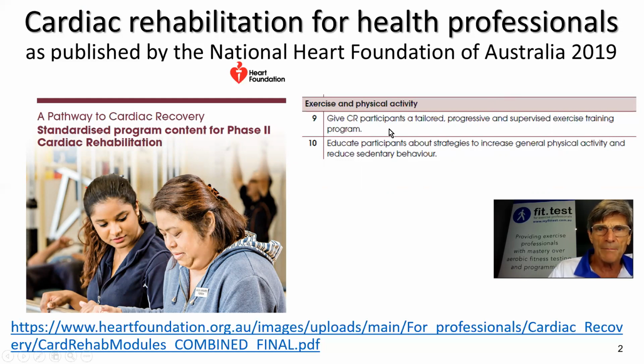One of the important things in the guidelines is a strong recommendation that participants in cardiac rehab programs should be given a tailored, progressive and supervised exercise training program. And of course, fittest is ideally suited to doing that.